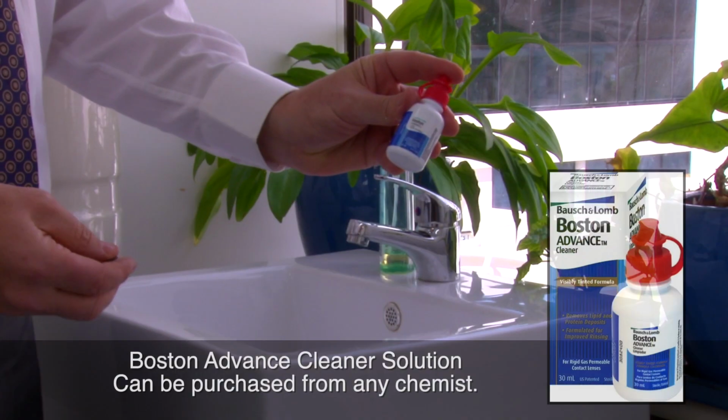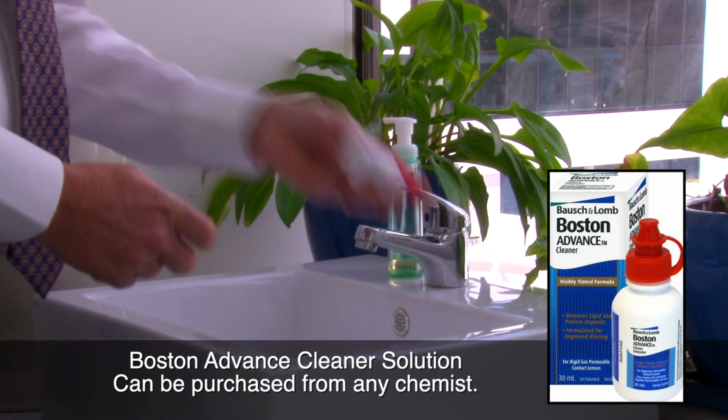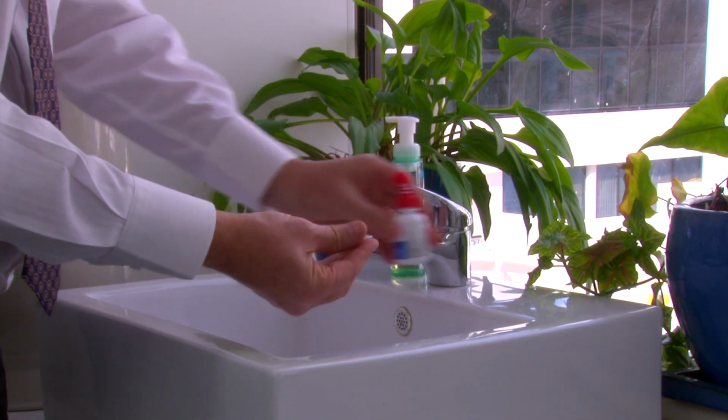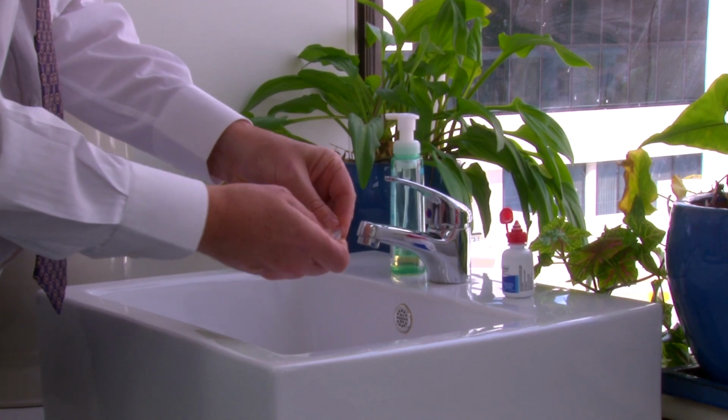If you need to use something stronger than water when you're cleaning it, there are a couple of very good cleaners. So there's cleaners for hard contact lenses. You get the little bottle, you shake it to make sure that the contents are all mixed properly. You put a bit into the back of the artificial eye and you give it a good rub with your thumb. This has got a polishing agent in it.